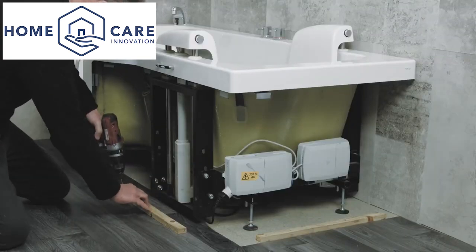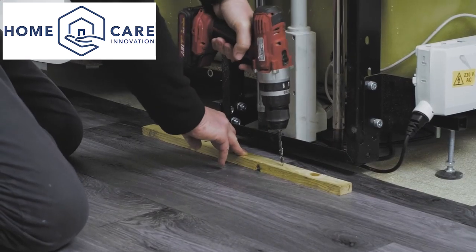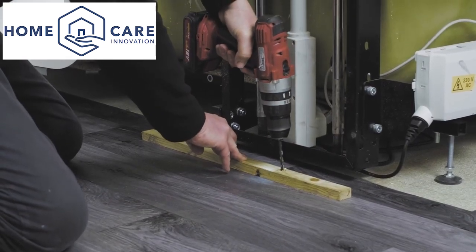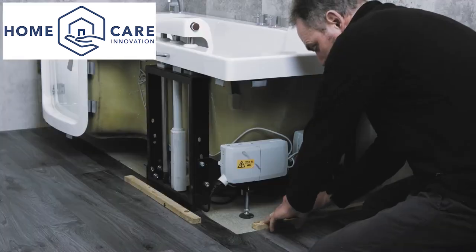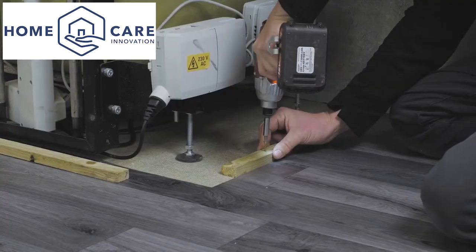With the bath still full, offer the panels up and mark the wall and floor for wood battens. The battens should be placed eight millimeters inside the vertical edge of the bath flange for a neat finish. These will allow the panels to have a firm fitting.